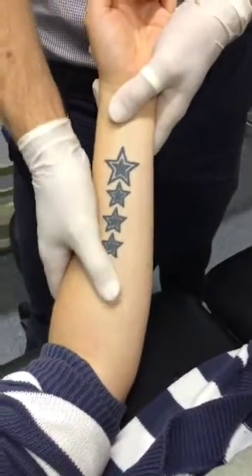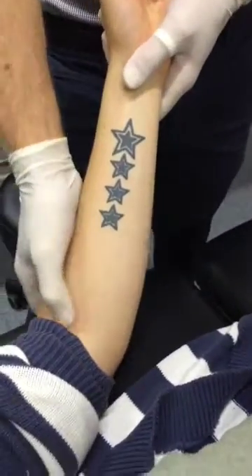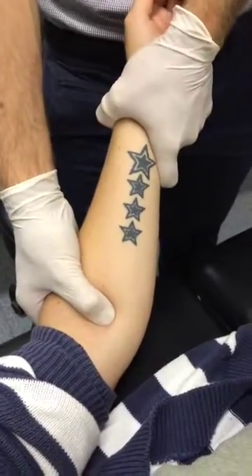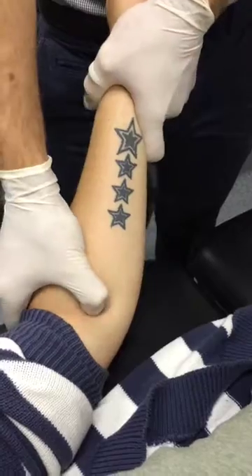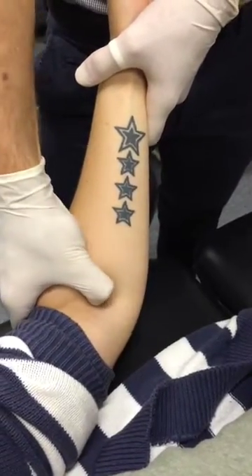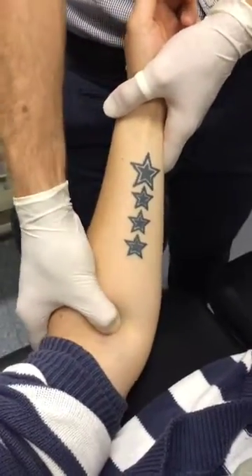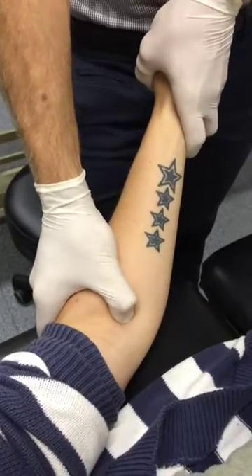Alright, so we're doing flexor carpi radialis now — we've just done pronator teres. Probably the easiest way to do it: find the cubital fossa onto pronator teres, just pronate for me. So that's it there, flicking over it. I just roll medially over it and push into sort of that gully there. You can feel yourself going over the muscle belly there, and we just get you to radially deviate, and I can feel that coming up.